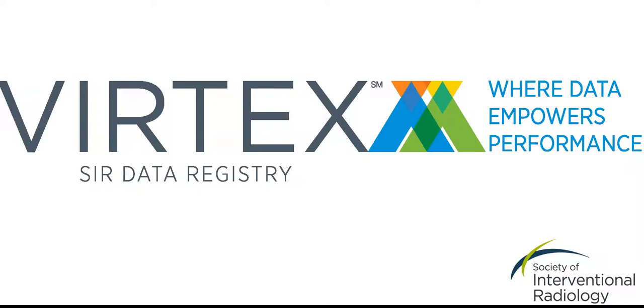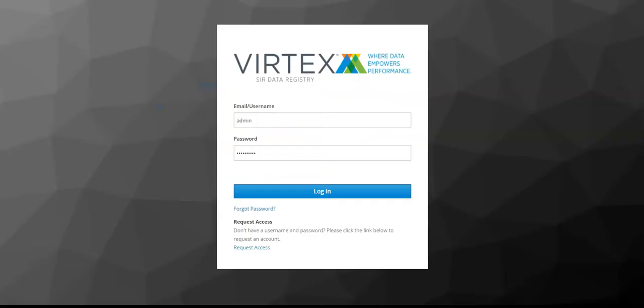Welcome to the VIRTEX Data Registry, a registry for clinical interventional radiology. The IR data captured in the registry can be used for tracking patient outcomes, improving patient care, and benchmarking against other programs.